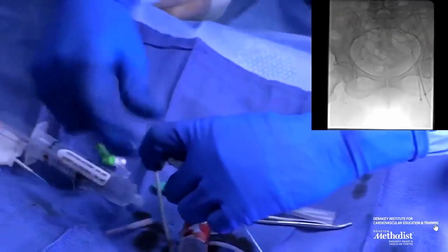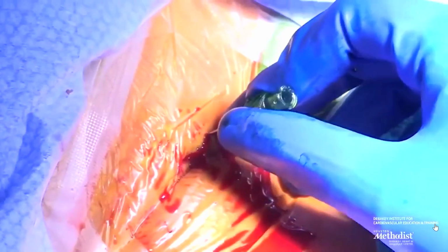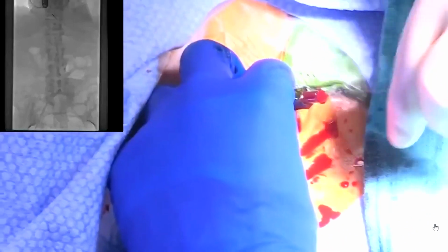We don't do this anymore, but we used to do this. You can see how the wire is crossing into the contralateral femoral artery, and we use that as a safety wire so that if we had any injury in the contralateral vessel, we can use that wire to tamponade it. Then we gain access into the main femoral artery. In most patients, that's the right side if the sizes are adequate.